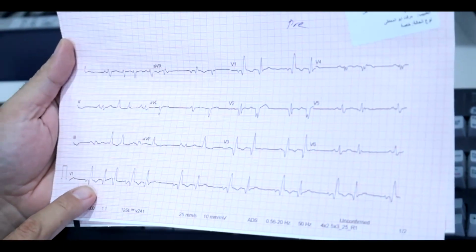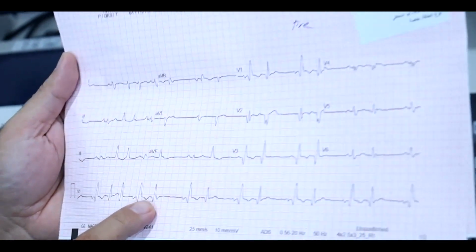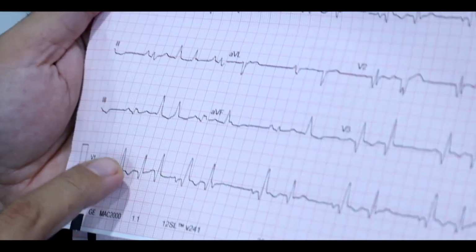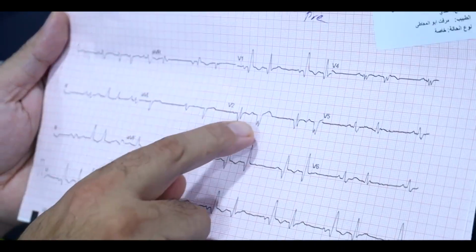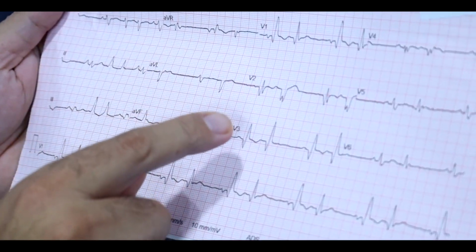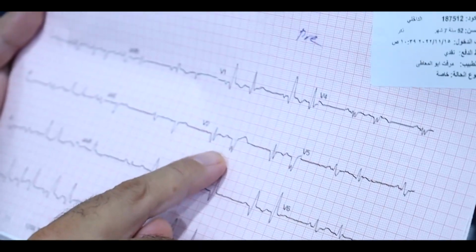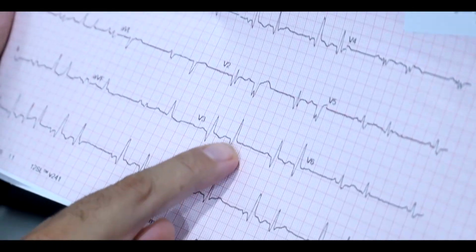These clinical PVCs come in not only a bigeminal rhythm but also sustained monomorphic VT, with the right inferior axis. It's a right inferior axis, right bundle, and W shape in V2. It's a very good ECG, where it's a right bundle with an R wave in V1, then it changes completely to a QS pattern in V2, and then again in V3.